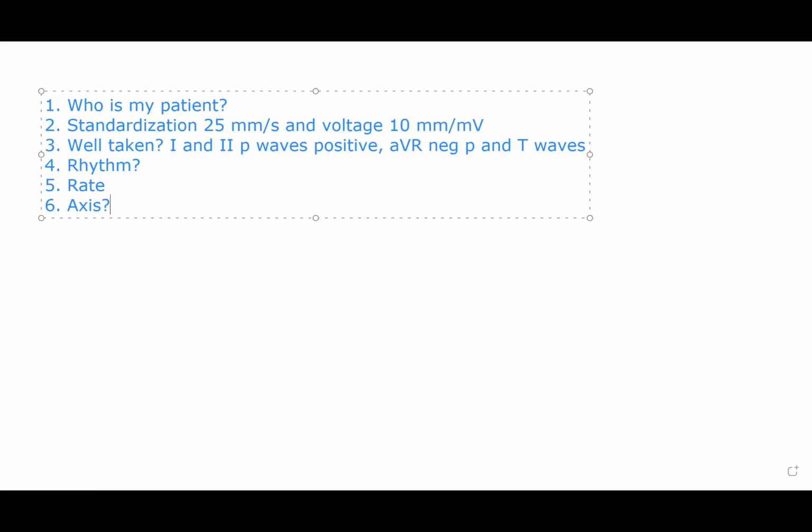But the last step, the one that I consider the 16th step, would be comparing with the prior EKG. That is very important. We'll jump back and forth from the lecture to this, but let me just show you something first here.